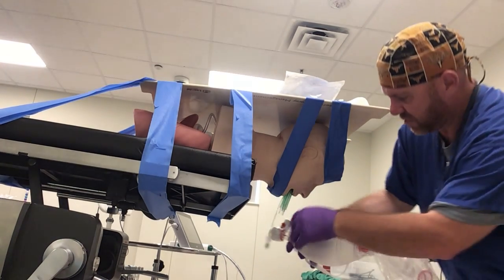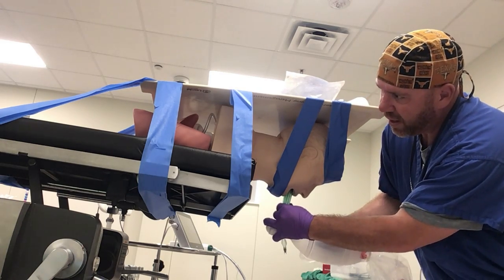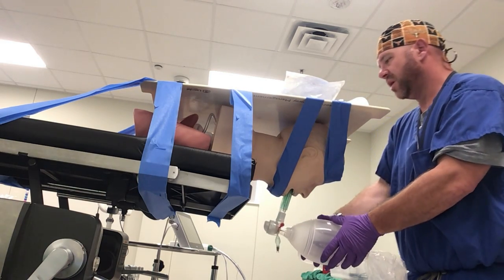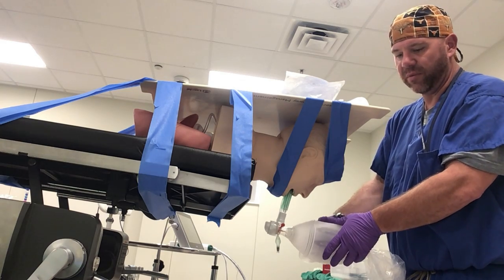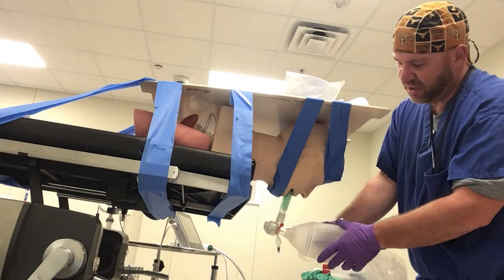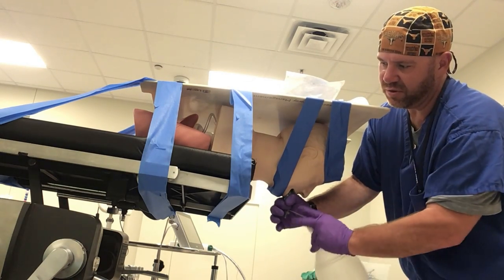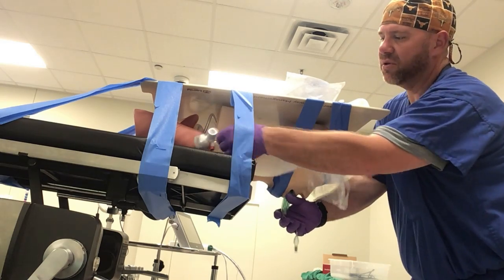And in essence, this removes part of the emergency from the patient. I'm able to ventilate the patient. In fact, if you had the availability of a bodine swivel, you may continue to ventilate the patient while you place your device. So the LMA is in place. I'm happy with my placement. The next thing I want to do is go ahead and place an endotracheal tube through the device.